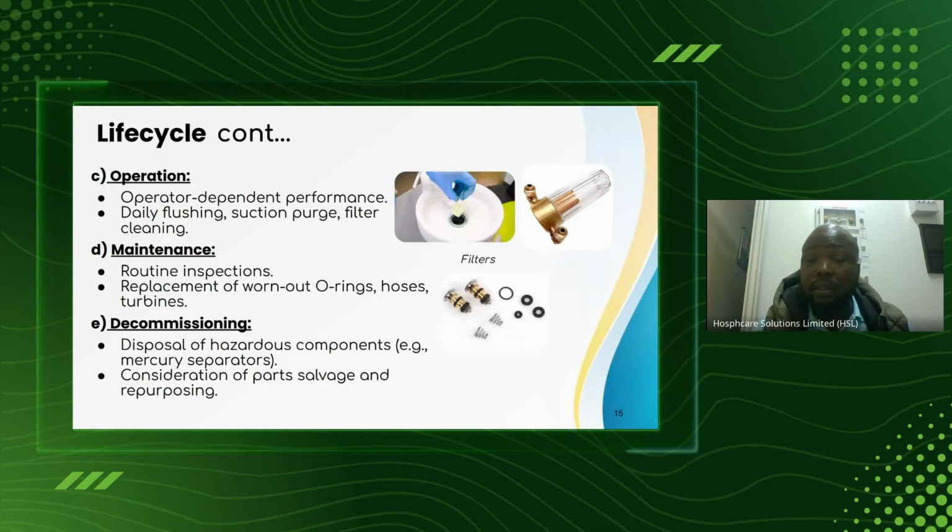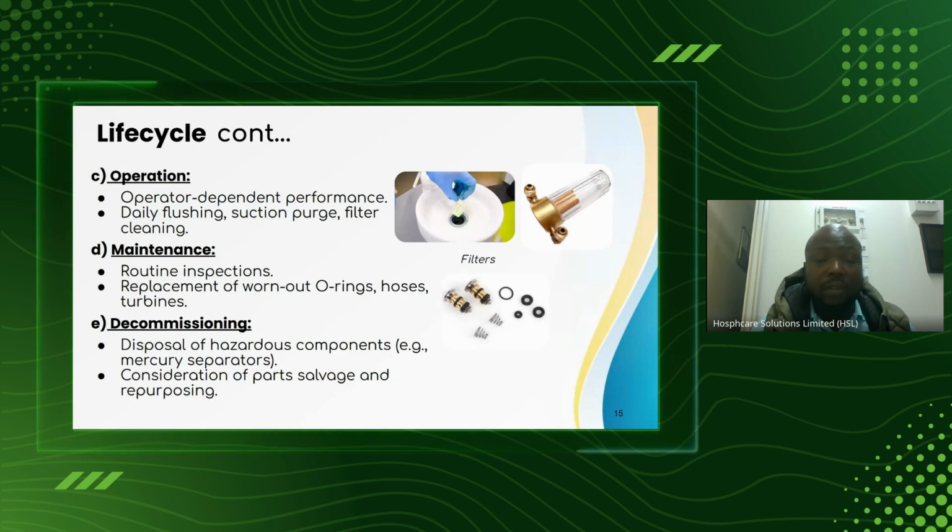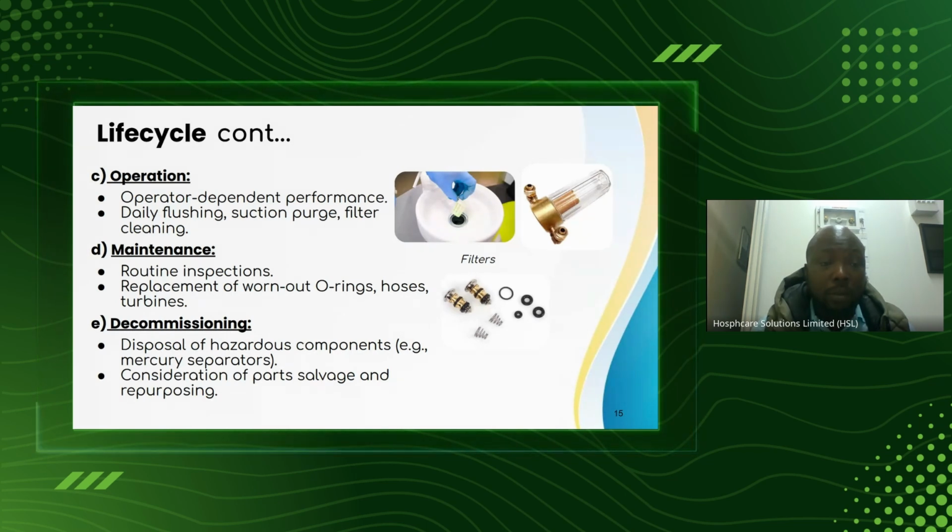This weak acid will be propagated via the water line to the tubings, the silicone tubings. These silicone tubings will change in their chemical compound, so they will become very brittle in a very short period of time. Compressors break very fast because of mismanagement of the compressor, or rather the quality of the water you are using.